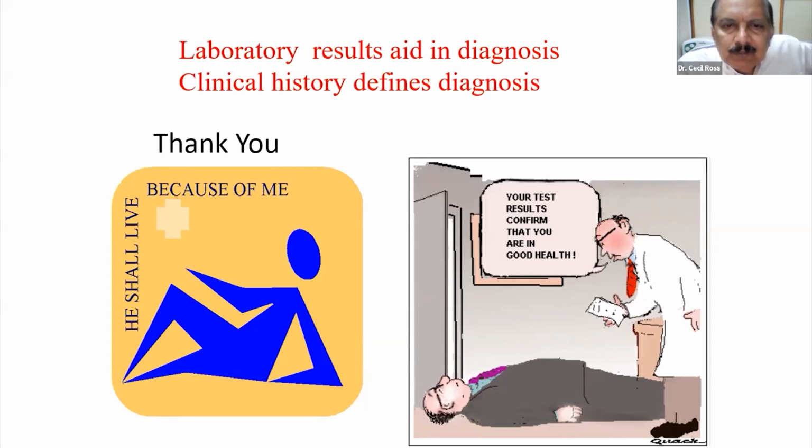How to correct sample volume in significantly low or high hematocrit? How to correct the sample volume? So you have to correct it for the hematocrit. The other thing is you have to take a smaller amount of blood and do the APTT.